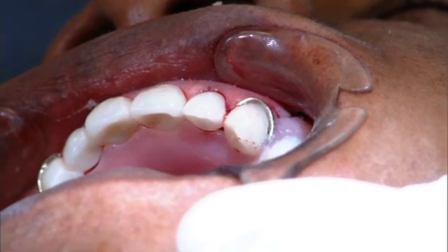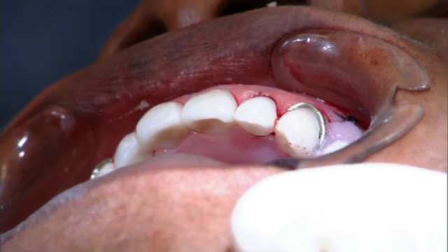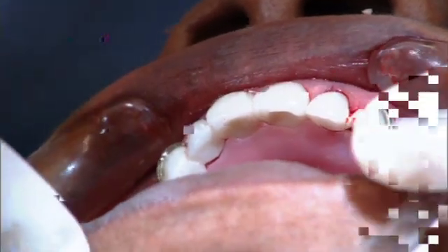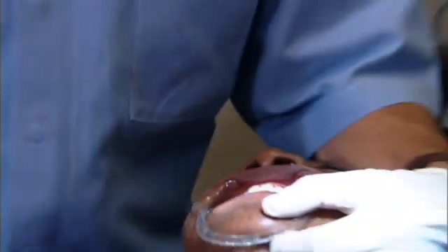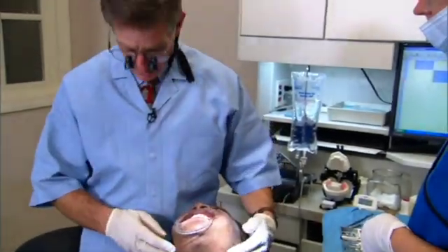We want to provide lateral stabilization, vertical support, and retention in this temporary partial. And our crown and bridge provisional is going to be doing that for us. We've cleaned the cement off. Right together on your back teeth now. We got our occlusion looking good, but Beverly is not going to wear her partial for about a week while she heals a little bit.